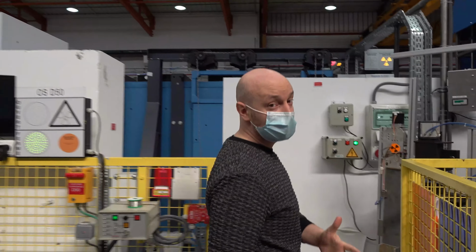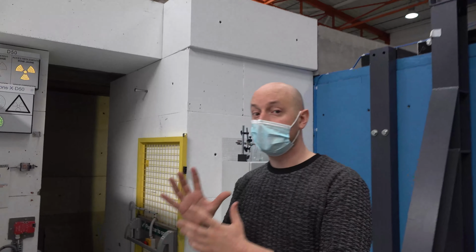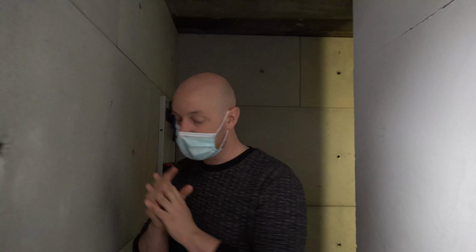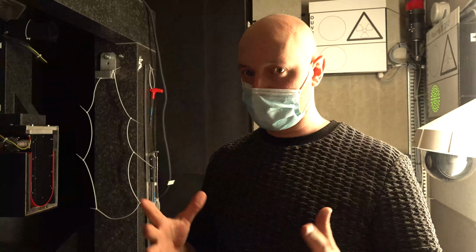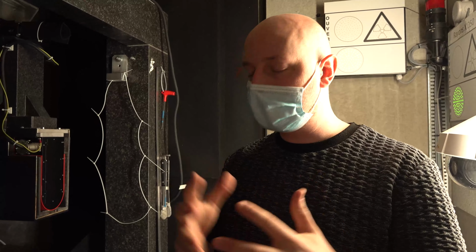So many of you will be familiar with radiography. If you go to the hospital and take a radiography of your hands, what you will see is a projection of your bones, typically across a plane. Now, in X-rays, what you see is essentially the bone because they are the denser part of your hand. That's because the opacity to X-rays is proportional to the atomic number of the elements and to their density.